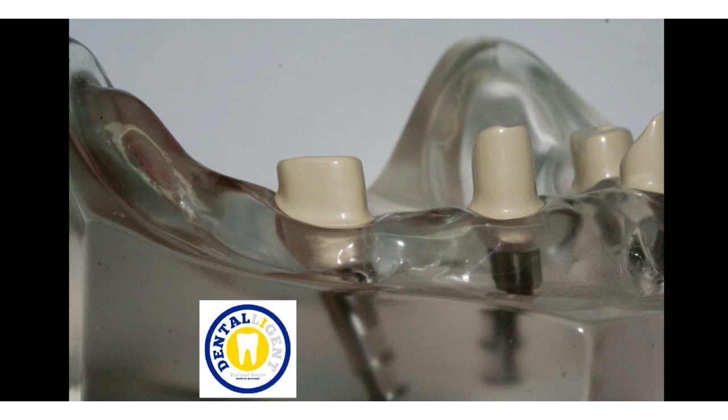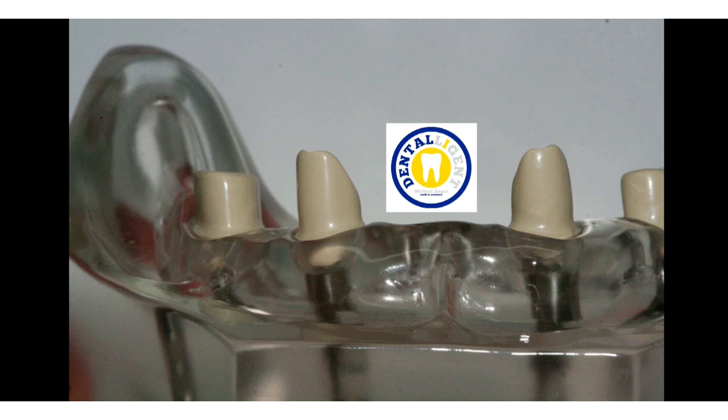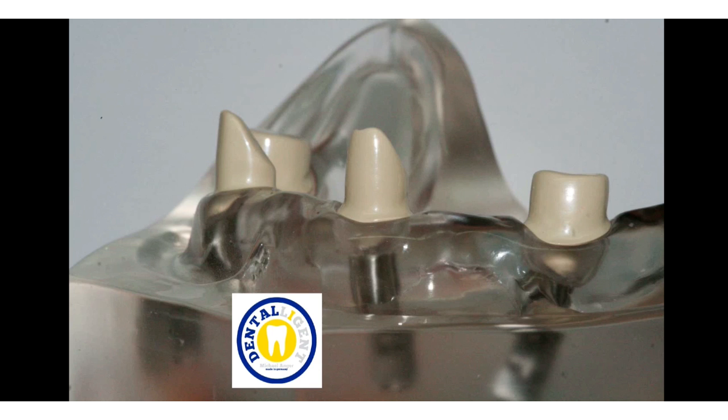In this view the strong angulation of the posterior implants is again visible — please note the well-polished surfaces. Also clearly recognizable in this picture is the settlement and the good polishing quality.